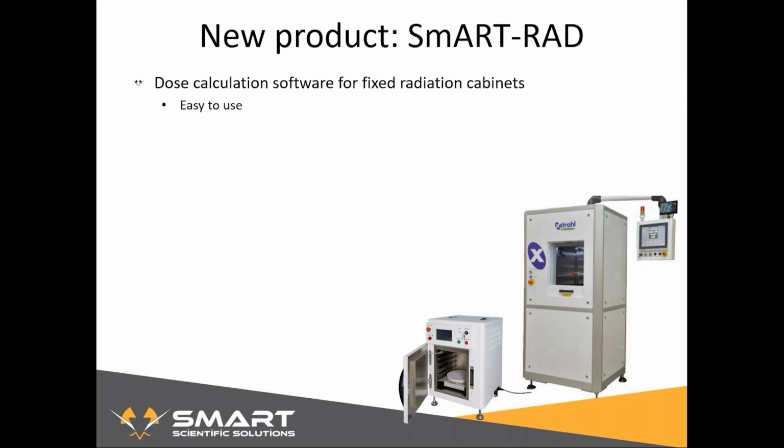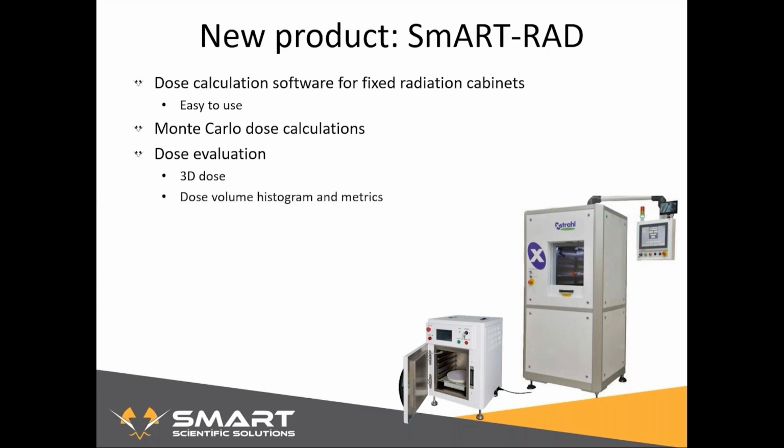This is all handled by the software itself, but it does use the gold standard calculation method, namely Monte Carlo simulations. It provides the user with advanced tools for dose evaluation, such as 3D dose through color washes, as you saw earlier already, but also things like dose volume histograms and metrics to analyze certain structures.